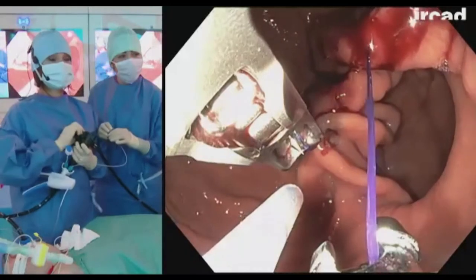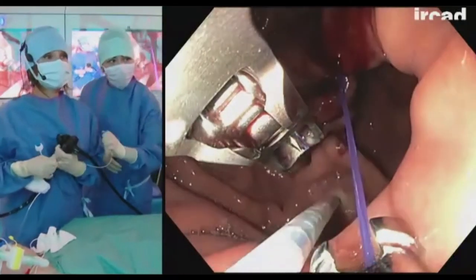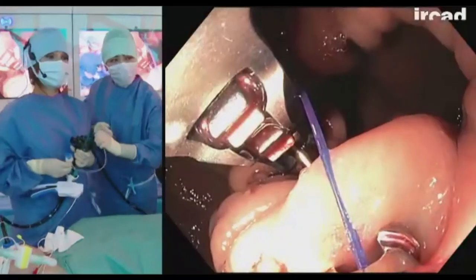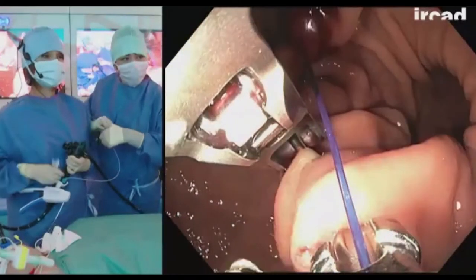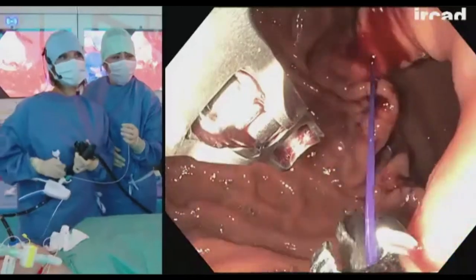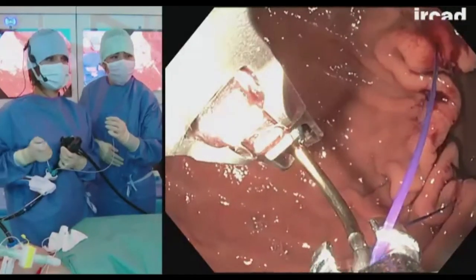So the good question here is, how much do I tighten this first stitch? And what I learned is that I have to go halfway through, like a hemicircumferential, in order to have something that is tight enough, but not too tight, so that I'm not over tightening. Because if we put this stitch too tight, we're gonna create a hypertensive stomach, and the stitches are not gonna hold well. So here I have half of the circumference. So we'll start going back, placing a U-shape stitch.